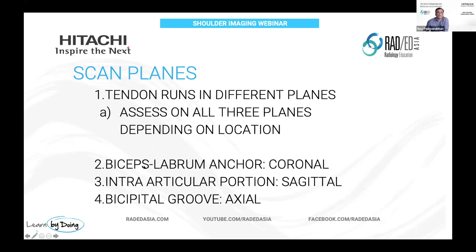If we're looking at the proximal portion — the biceps labrum anchor, where it attaches — probably the best way to look at that is on the coronal scans. If we're looking at the intra-articular portion, it's predominantly the sagittal images; we can see it on the coronal slices, but the sagittal scans are better. And if we're looking at the bicipital groove component, you need to be looking at it on the axial scans, because it's hard to see on the other planes.